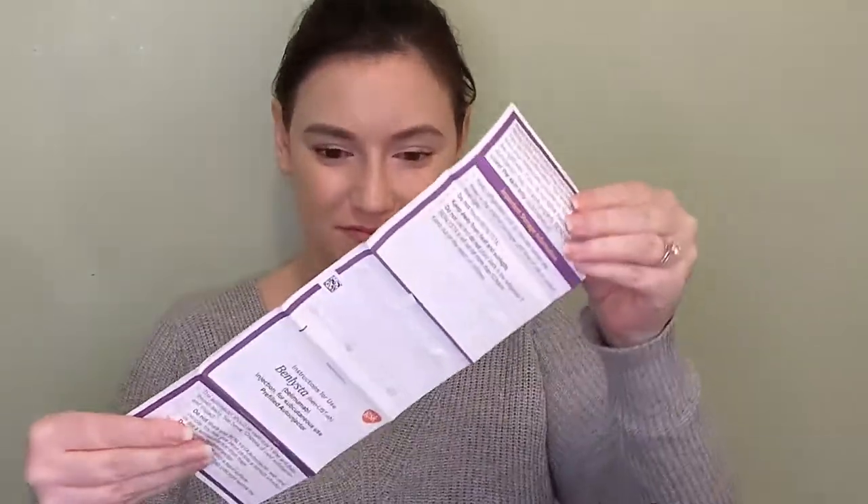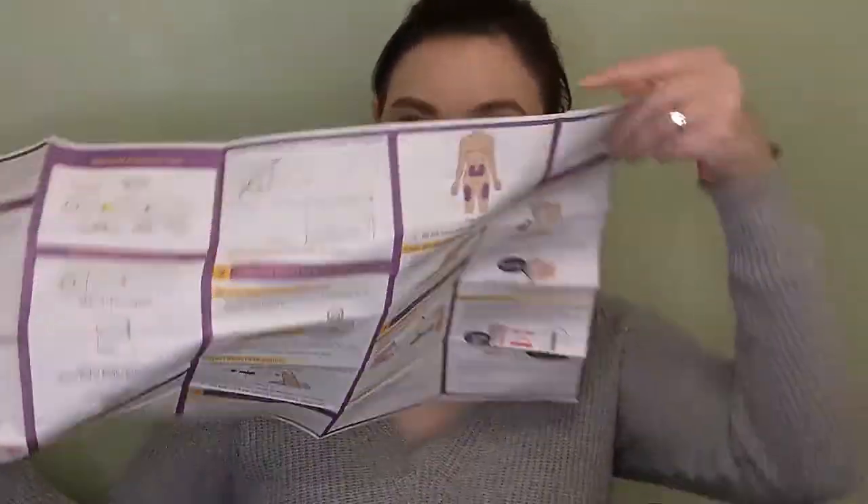It does come with a leaflet of information — there's actually a whole other one too. There are a lot of instructions. I've been doing this myself for about a year, so I don't think I'm going to read all of this to you because when you get Benlysta you'll get this whole packet yourself. But I will go over the steps and show you how I do my injections.